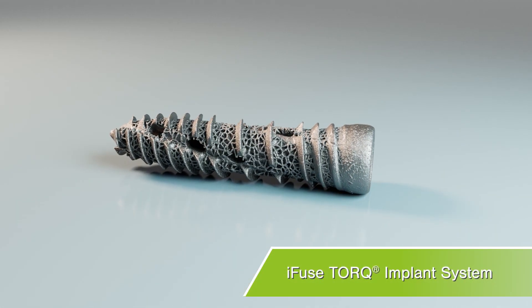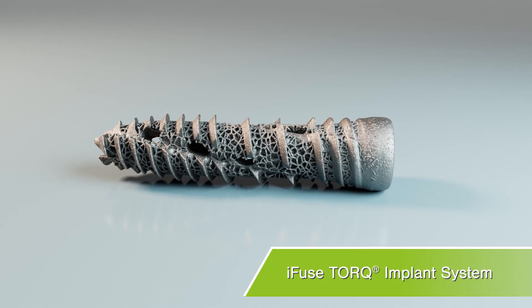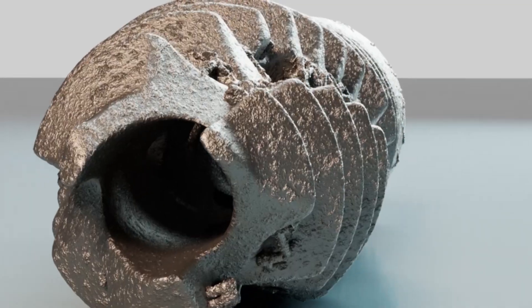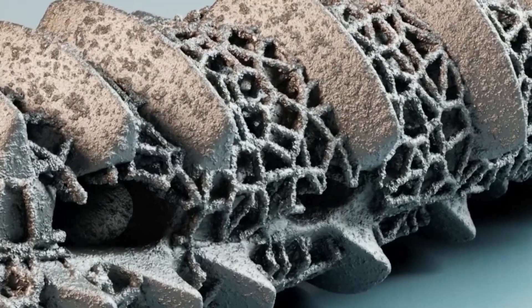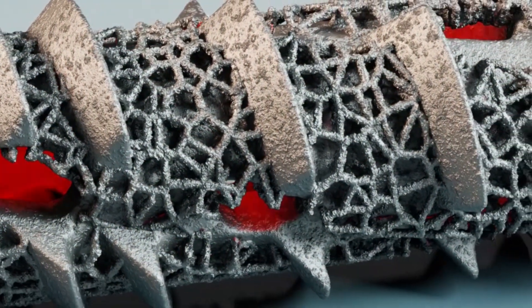The iFuse Torque implant system was designed specifically for minimally invasive stabilization and fusion of the SI joint. The iFuse Torque implant was designed to optimize SI joint fixation and fusion, allowing for bone to grow on, in, and through the implants for long-term fusion.